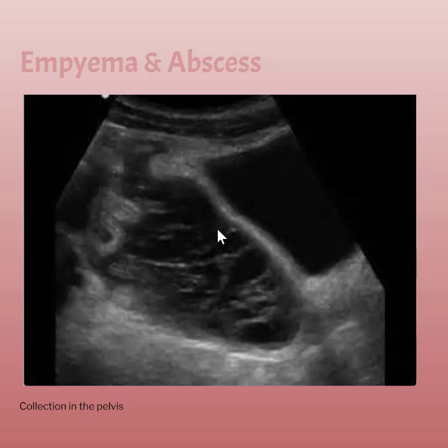Here is a loculated area down in the pelvis. We have the urinary bladder here, and then we've got this loculated, kind of gross looking, irregular-walled, complex mass in the area. We also have some bowel in the area as well, so we would want to make sure that this is peristalsing, not adhering to this mass.